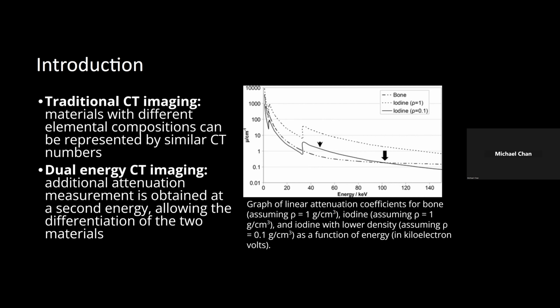So dual energy CT actually tries to address this limitation by imaging structures at two different energy levels and using some complex math that is beyond me in order to decompose the signal into different constituents like iodine or calcium, etc. So by using this technique, we're able to unlock this powerful ability to discriminate certain elements within the image.